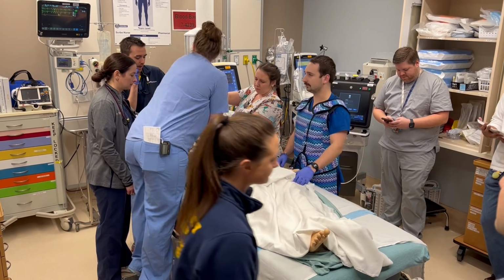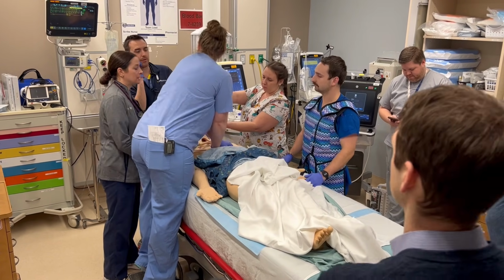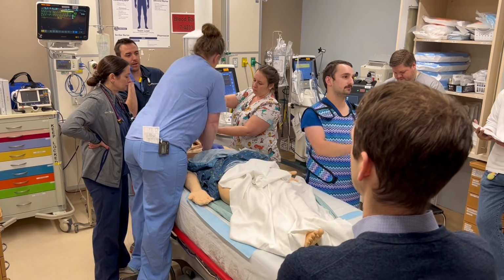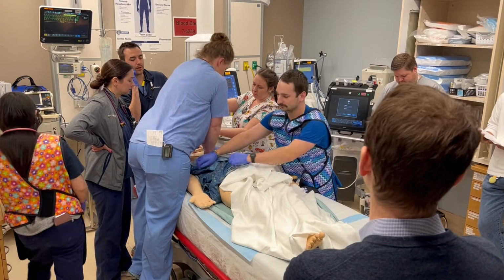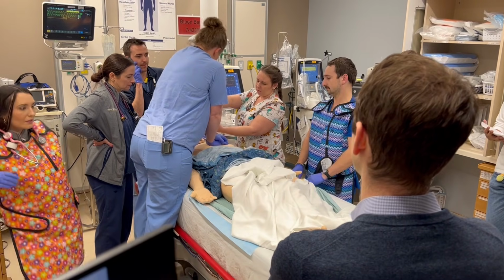He does have severe blunt trauma. He has had a CT, yes, we can do that too, for thoracic or abdominal bleeding. Compressions have just been started. 1 milligram of epi given. 14 years old.